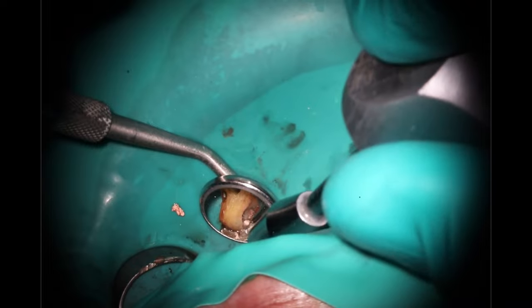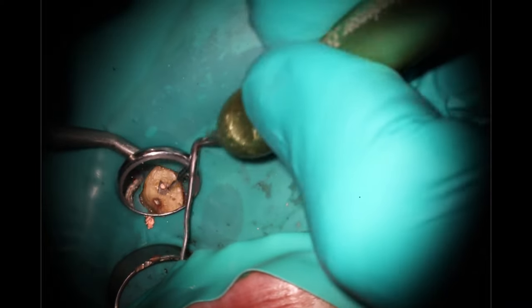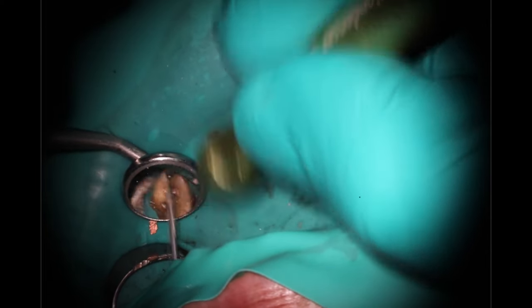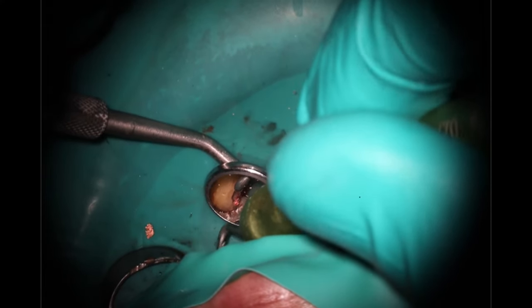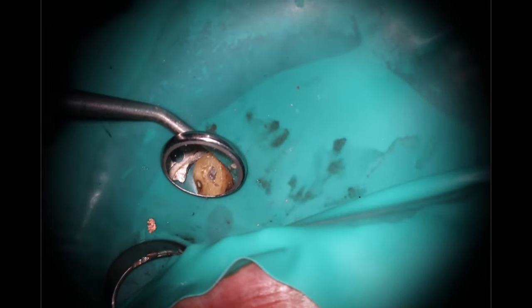This is another one that is technique sensitive. I hated it the first time I used this thing because I wasn't using it as it was supposed to, and it just ripped all the gutta-percha out — cause it's a Hedström, that's what they do. Making sure everything looks good here — happy with the palatal, happy with the MB. The distal buccal though is a little bit low. I'm going to make sure that we have a nice solid platform for the dentist to build his composite against in the distal buccal — the PACMAC did rip out a little bit extra. So I'm going to come back in here with the beta, just fill that up so it looks nice and pretty.